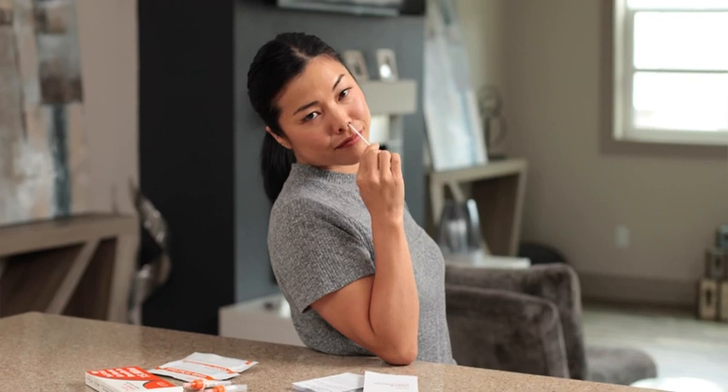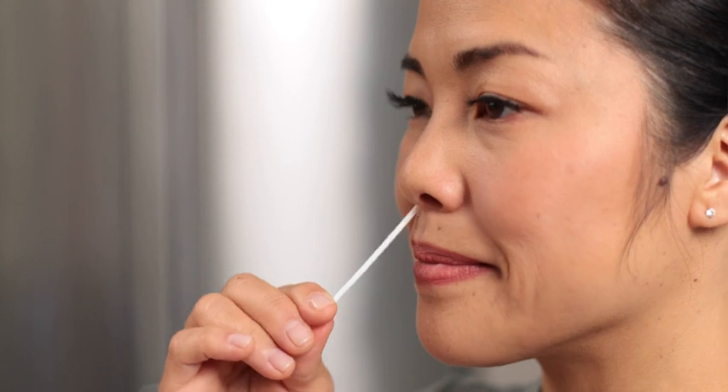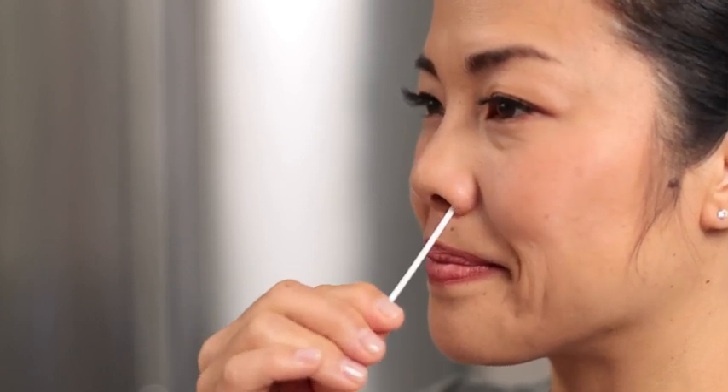In a circular motion, swab as if you were cleaning the inside of your nose. Note that this is not a matter of simply twisting the swab in place. When you've finished, swab your other nostril the same way. You think you got it bad? I'm the one who has to keep saying nostril.